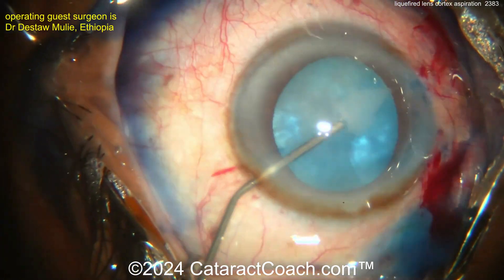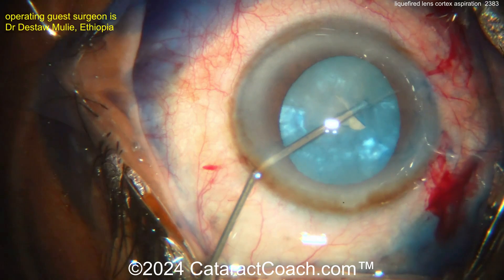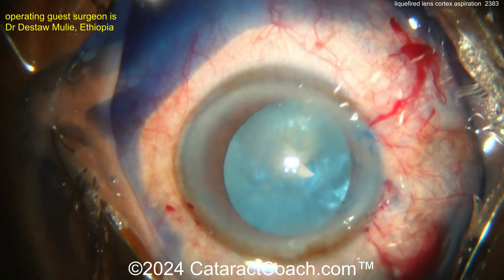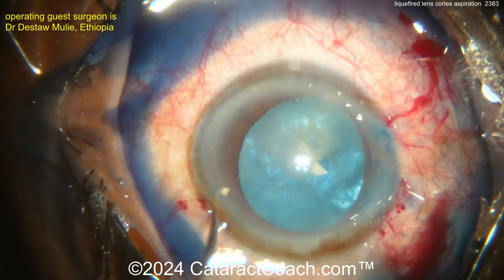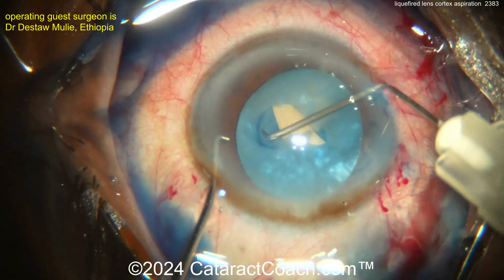That was removed going from the other side as well — you can aspirate more. Remember to rock the nucleus, because there's still liquefied lens cortex behind the nucleus, between the nucleus and the posterior capsule. It's important to release all that fluid. Great job here — now you can go inside and complete the capsulorrhexis.